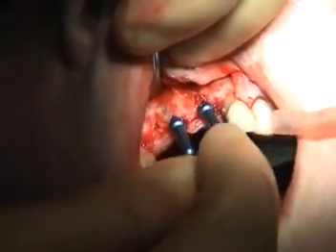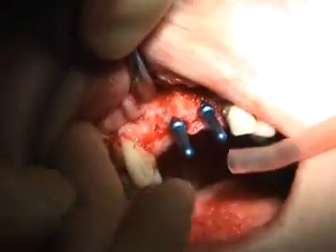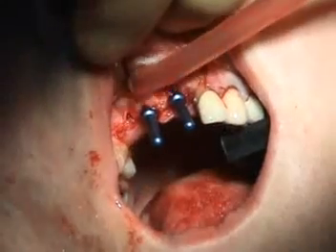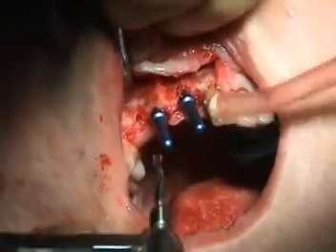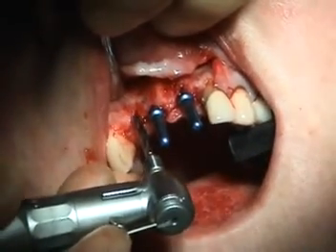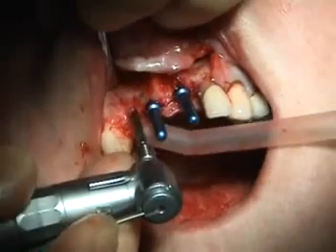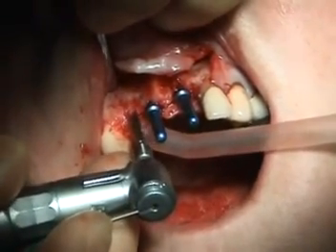A second guide pin is now introduced into the upper right central incisor area to compare the angulation with the existing preparation for the left central incisor region. In this way, the preparation for the right lateral incisor region can be commenced with confidence.